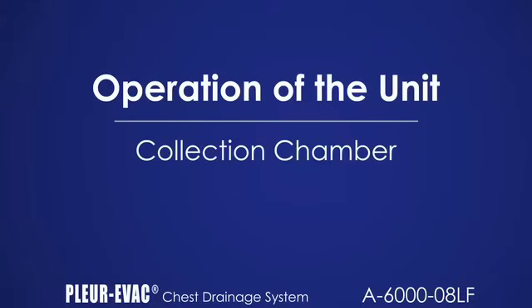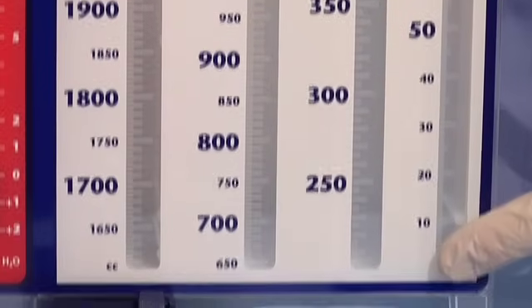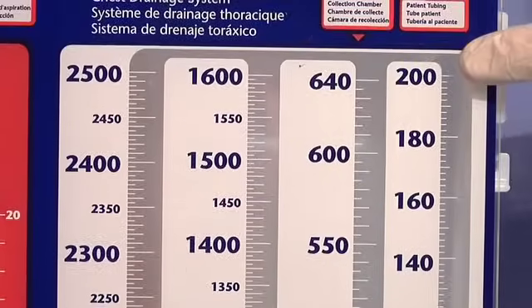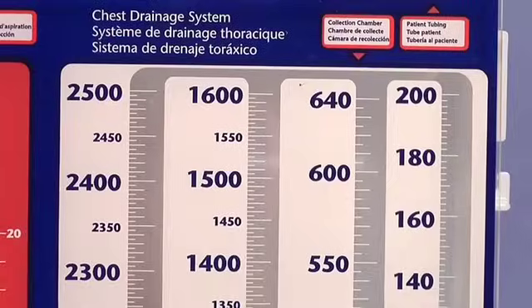The collection chamber has a capacity of 2,500 cc's. There are four columns within the chamber. Increments of measure are 1 cc up to 100 cc, then 2 cc to 200 cc, and then 5 cc increments to capacity. Monitor the collection chamber and replace the unit before capacity is attained.